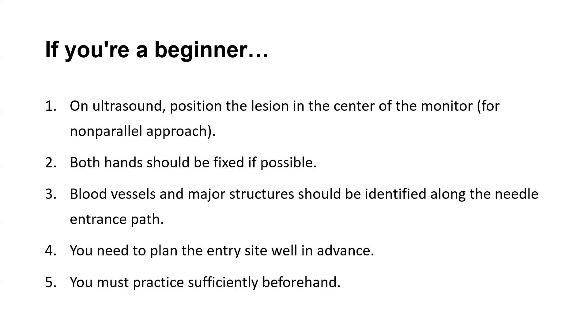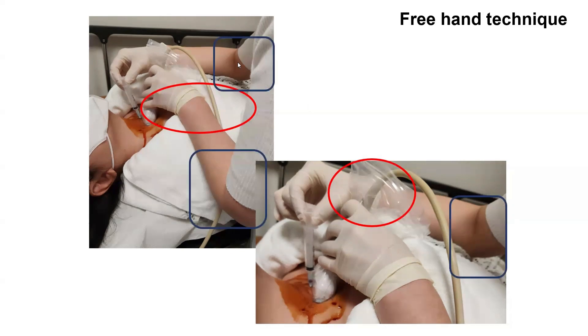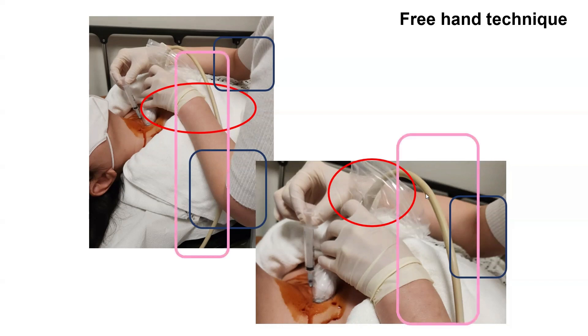You must practice sufficiently beforehand. As you can see, both wrists lean against the patient and fix it. It is also advised to secure both elbows to the patient's body. FNA demands sensitive movement, so fixing the ultrasonic probe line, which might be hefty, with the left arm minimizes its weight, making FNA easier.